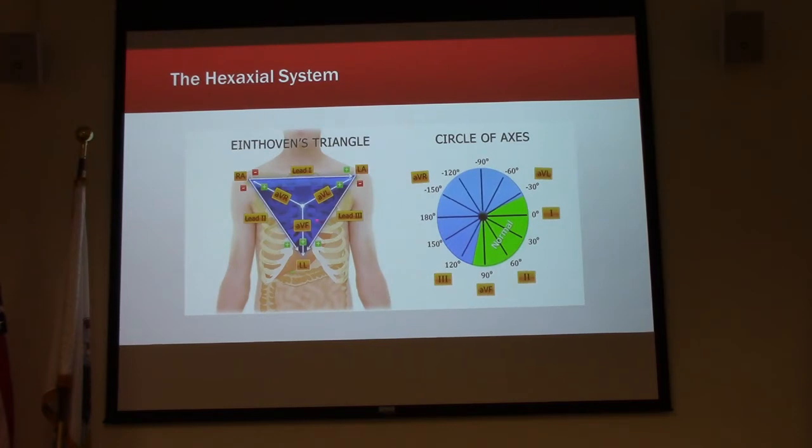But in some of our patients, the electrical activity doesn't necessarily follow that. It may come down to this area, and there may be some type of conduction problem, dead heart tissue, problem with the electrical pathway, and it'll send the electrical impulse to a different direction. And that's when we start talking about the different axes of the heart. Now, this 0 to 90 degrees we consider to be a normal axis. If a person's electrical activity comes down and ends up going to anywhere in this 0 to 90 degrees, that's fairly normal for them.